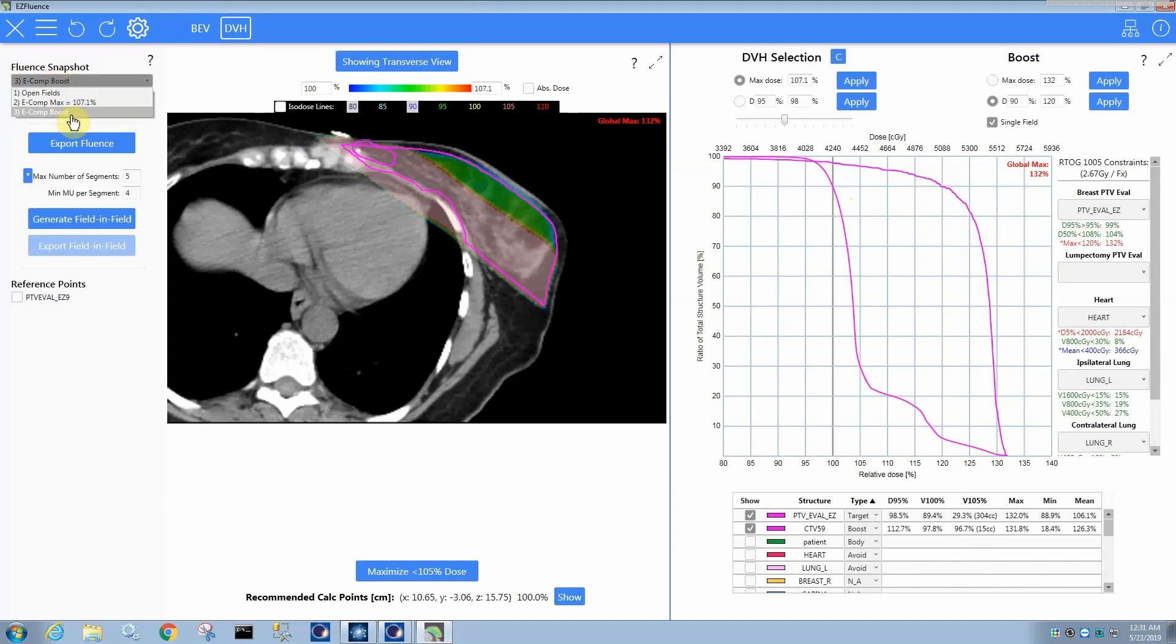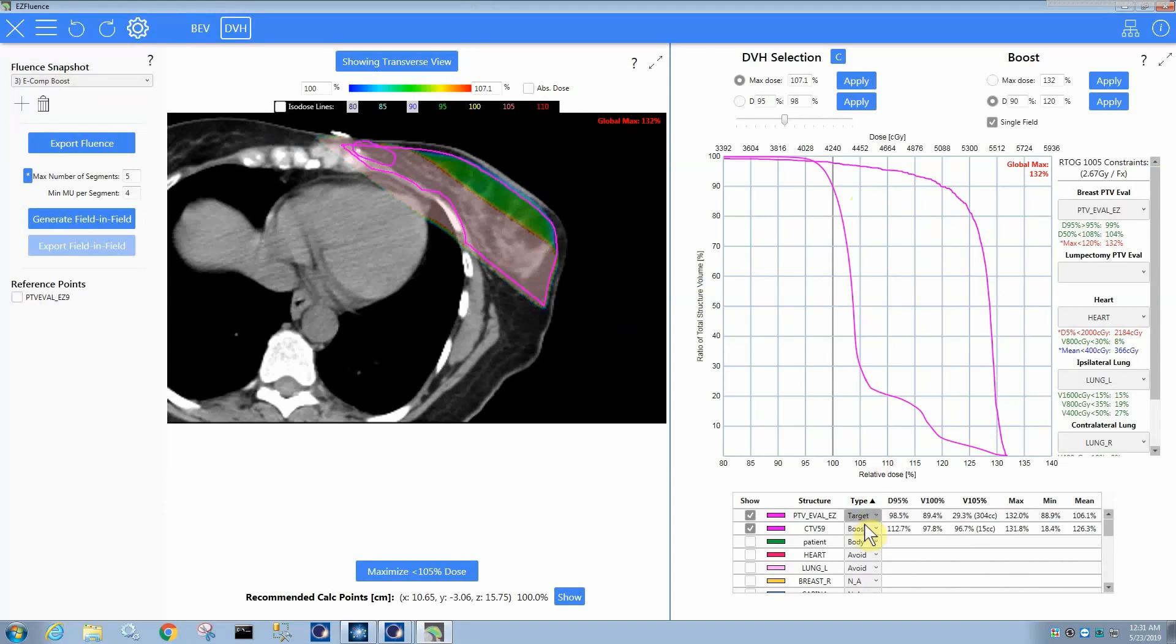It also creates a new snapshot every time you do it, so you can fiddle with it and then jump back and forth if you want to compare. And so, basically it just comes down to setting the boost type to boost for the structure you want to control the dose to, telling it how much dose you want it to get or a max dose and whether you want a single field and then applying that particular boost approach.